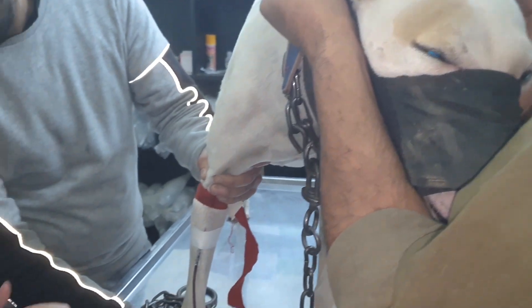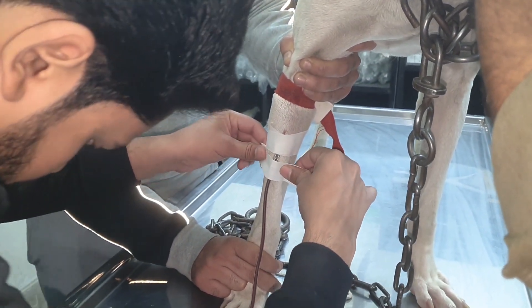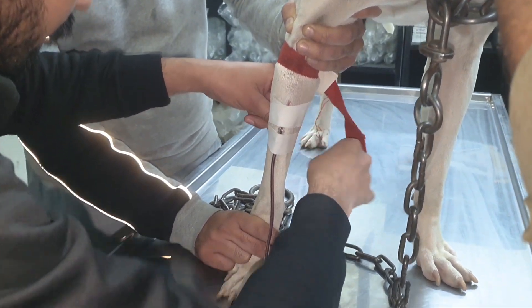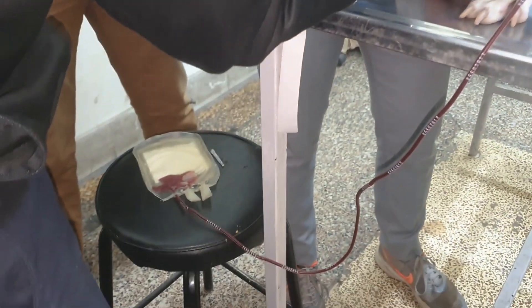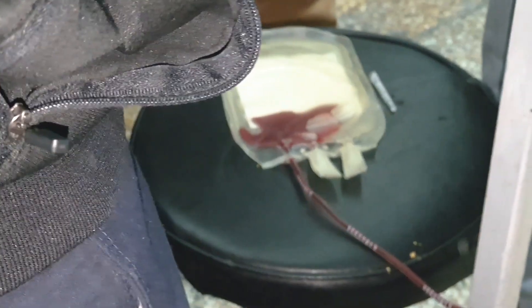If the donor is a female, her blood should not have been sensitized by multiple previous pregnancies. To avoid mismatching, a cross-match test can be carried out by mixing the serum of the recipient with the cells of the donor. Alternatively, we can inject a small amount of the blood into the recipient.